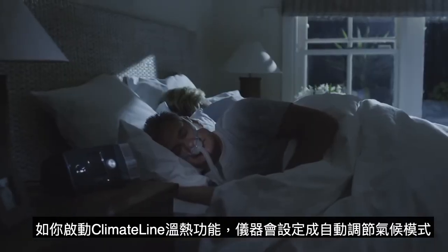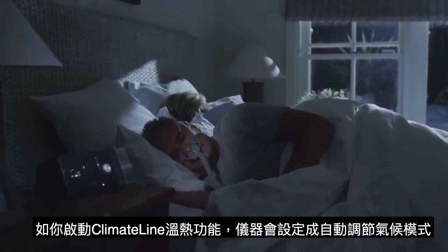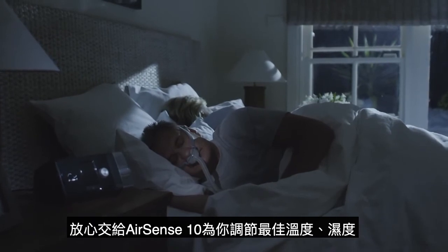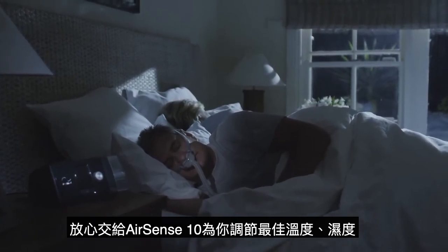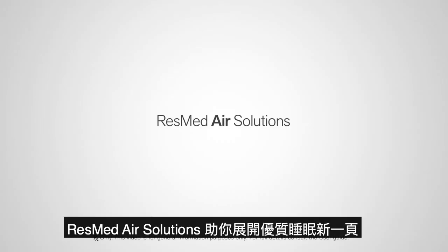If you're using the ClimateLine Air heated tube, your device will already be set up in climate control auto mode, so you can experience therapy at the most comfortable temperature and humidity levels without having to do a thing. ResMed Air Solutions — a new beginning in great sleep.